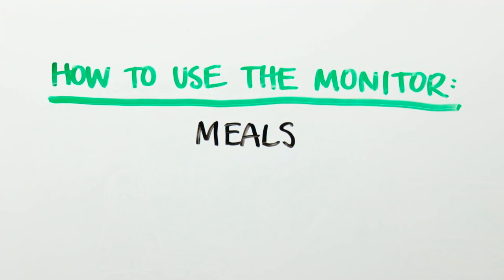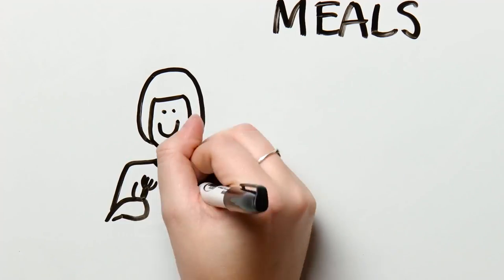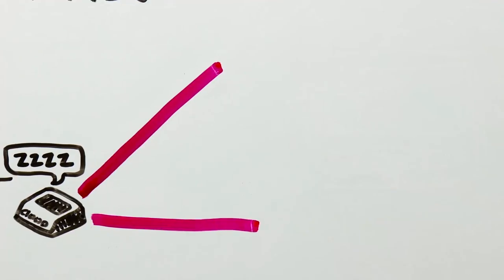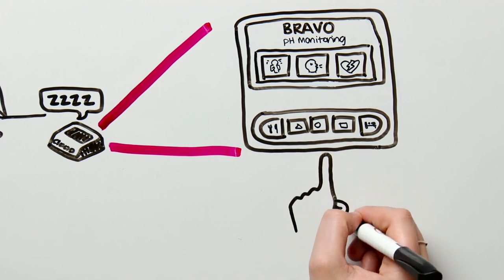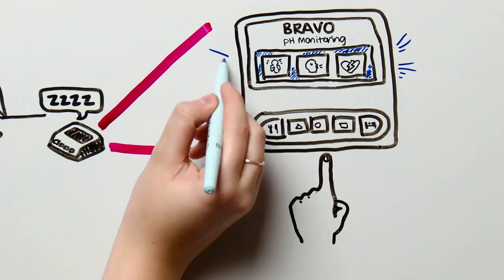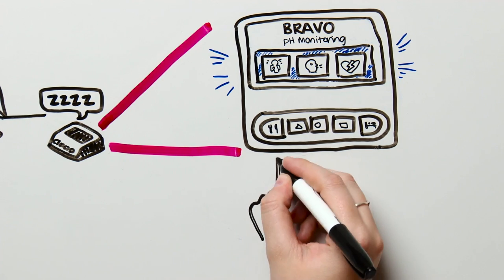Now let's take a look at what it looks like to use the monitor to record your meals. First, you wake up the monitor, which you can do by pushing any of the buttons. When you push any button, you will see the monitor backlight come on. Now that we have the monitor awake, push the meal button.